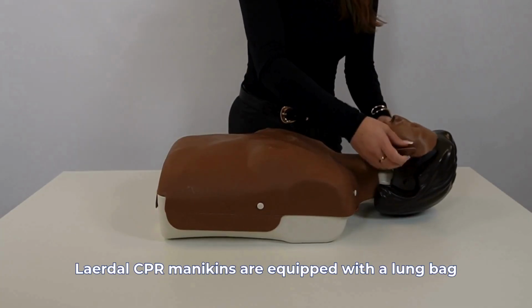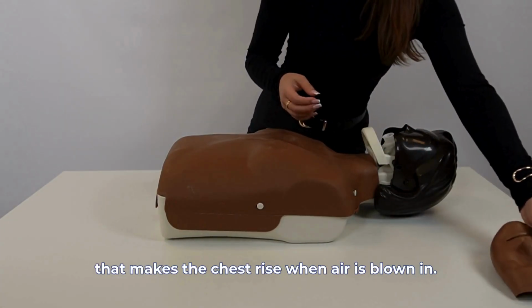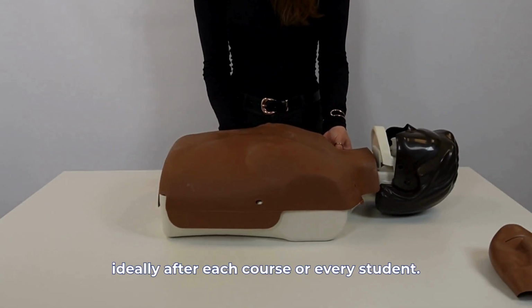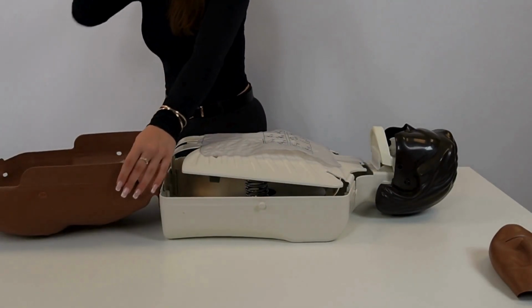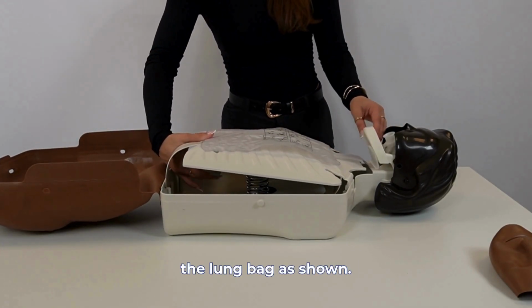Laerdal CPR mannequins are equipped with a lung bag that makes the chest rise when air is blown in. This lung bag should be replaced regularly, ideally after each course or every student. Here's how to do it. Remove the facial skin from the mannequin and replace the lung bag as shown.